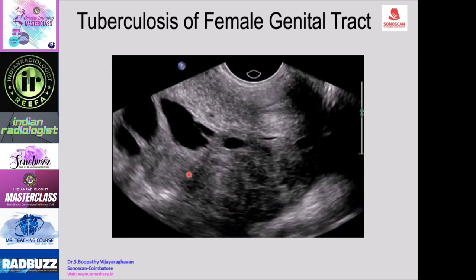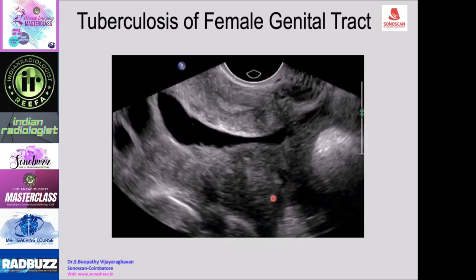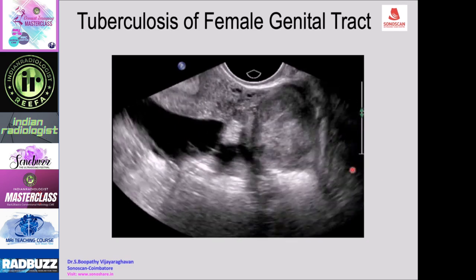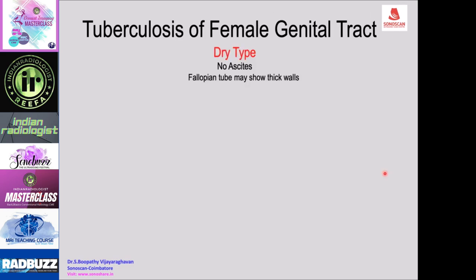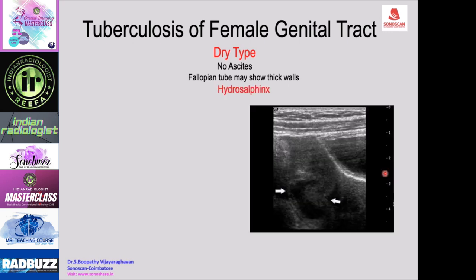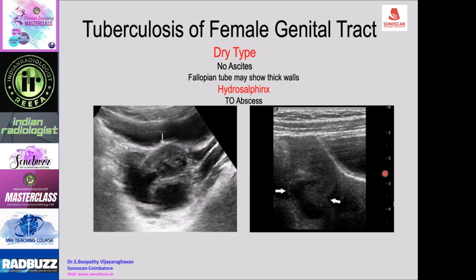On the left side, hydrosalpinx is present alongside the markedly thick-walled fallopian tube. In a young girl, abdominal scan shows hydrosalpinx with a thickened fallopian tube, a mass involving the hydrosalpinx and ovary, and peritoneal thickening, which can represent a tubo-ovarian mass or tubo-ovarian abscess.